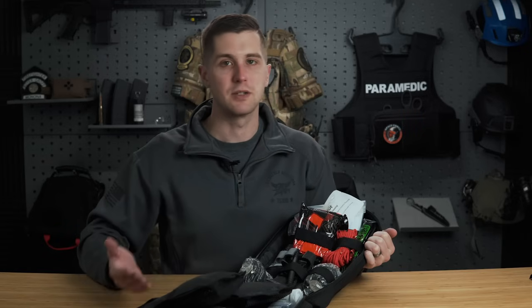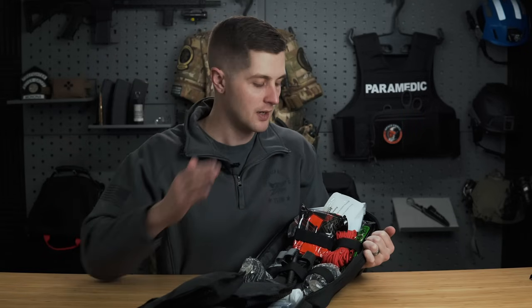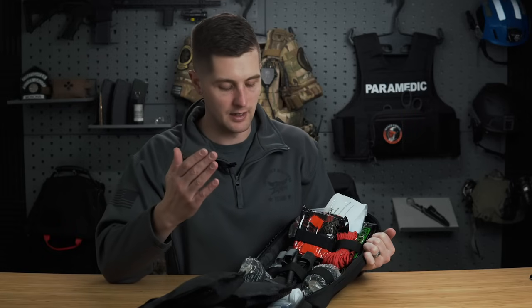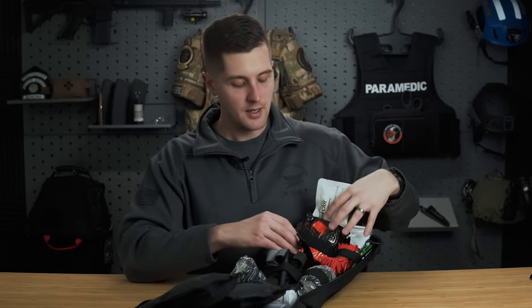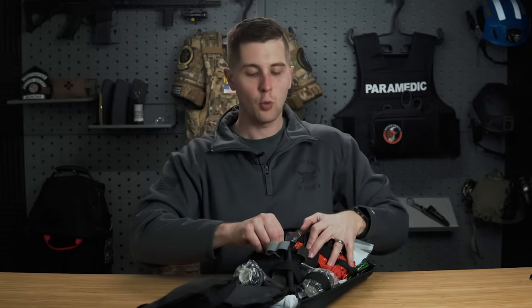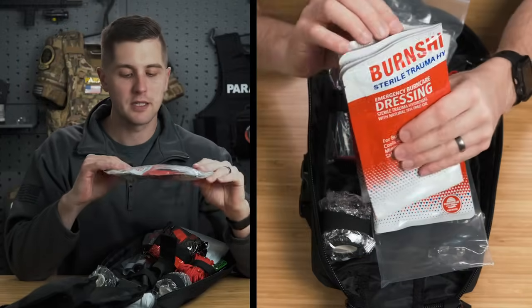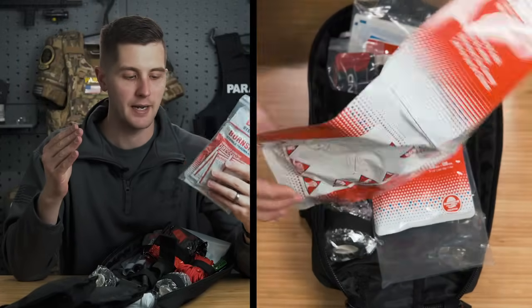You can use that. Lots of uses for it, or just flagging down a helicopter or searchers, something like that. Very useful to have a Chemlite of some kind in there. Now, as we come down to this next pocket, once again, one of these hidden pockets kind of behind everything, we have basically a burn packet here.